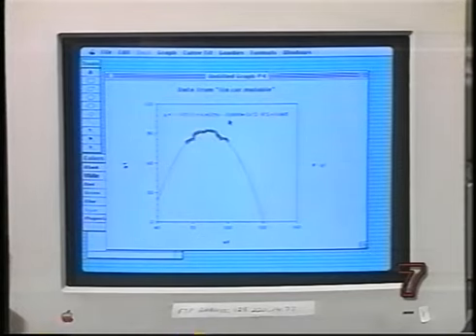This number gives us very important information about the tongue, about the shape of the tongue at this moment in time. The negative sign indicates that it's an arched tongue rather than a grooved tongue. And the absolute value of the number tells me how steeply arched the tongue is, whether it's flat and gradual or whether it's very steeply arched as it is in this case.